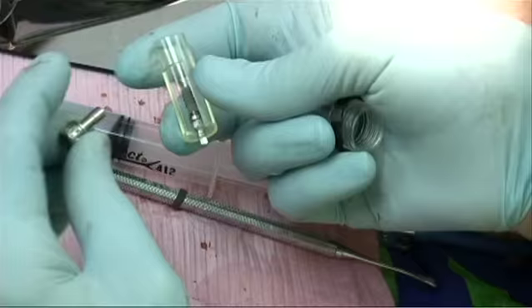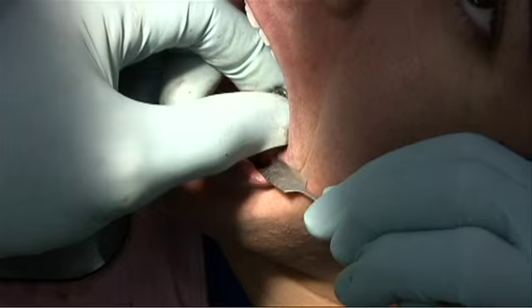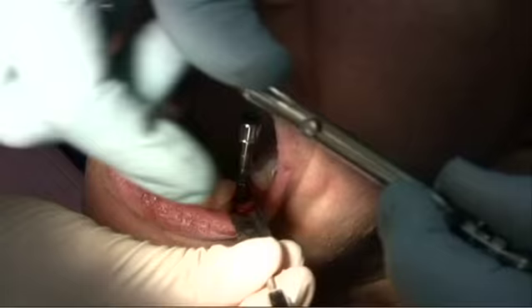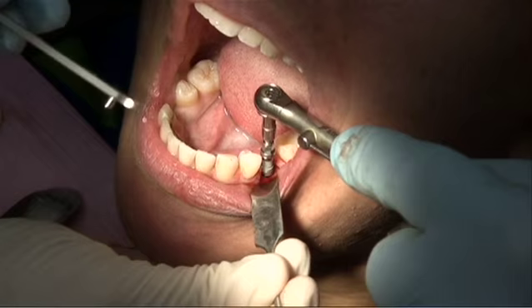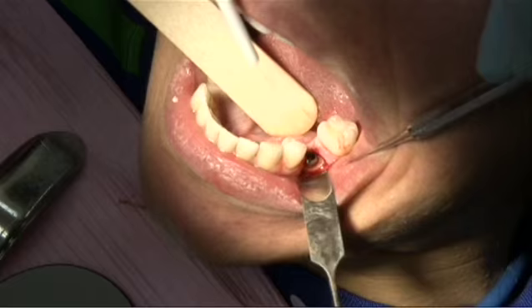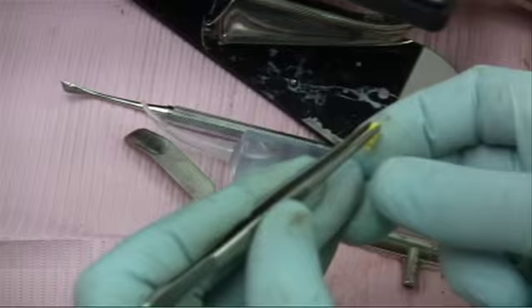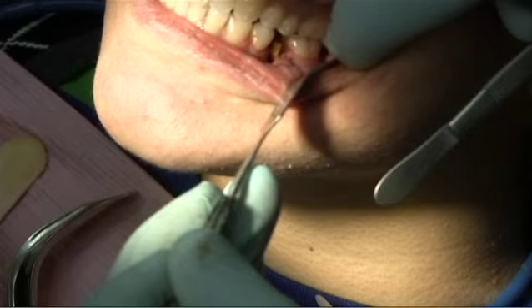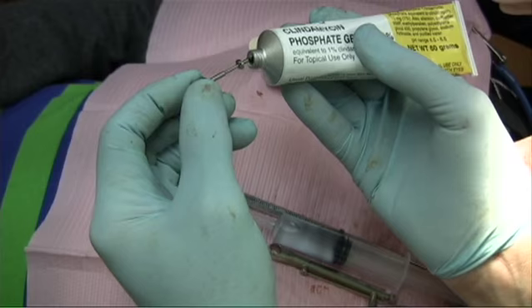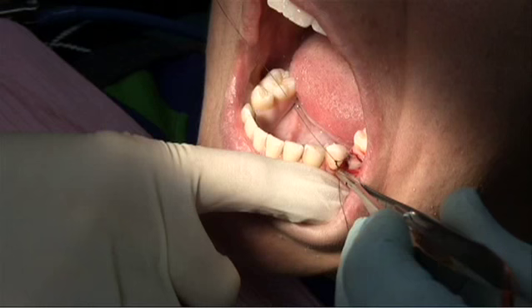The same protocol may be used for the Blue Sky Bio implant as well. The Blue Sky Bio implant uses a mountless design as compared to the Straumann. A conversion kit is available for their insertion driver, which will allow you to use the Straumann torque wrench. The implant shows excellent stability with an insertion torque of 35 newton centimeters. At this time, it is advantageous to select the appropriate abutment height. The Straumann prosthetic kit is very helpful in the selection. The plastic try-in abutments are plastic replicas of the final abutment. This shows appropriate clearance for crown fabrication. The healing cap with antibiotic gel is placed and the flap is sutured with 5.0 silk, followed by a Peridex rinse.